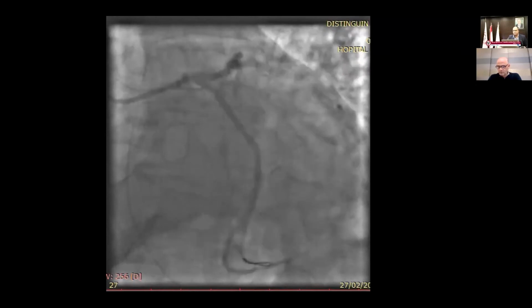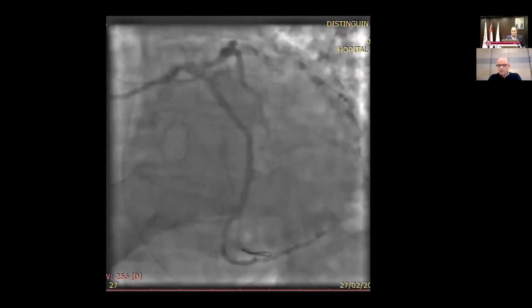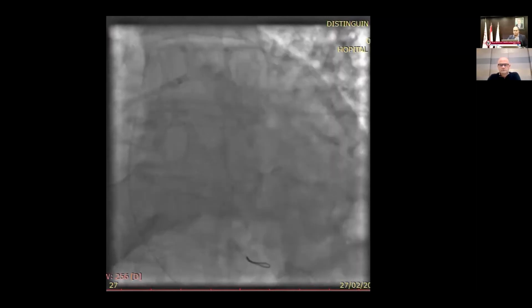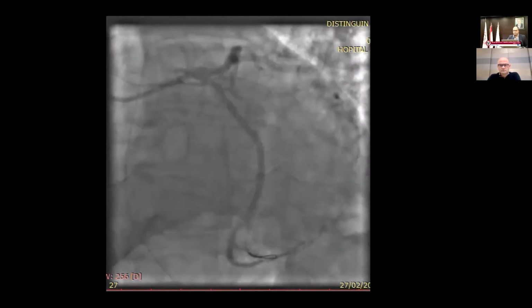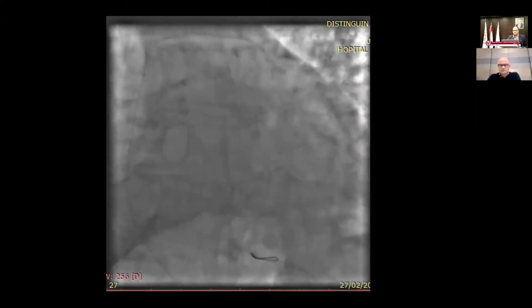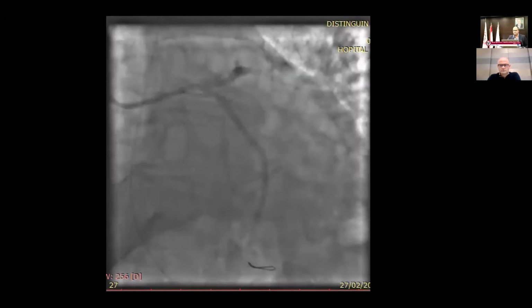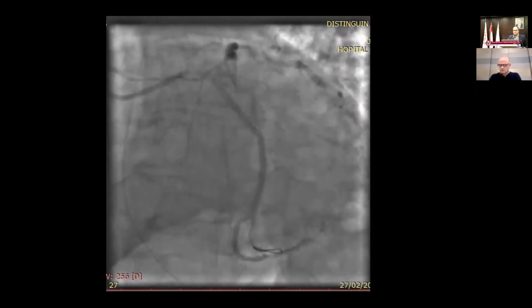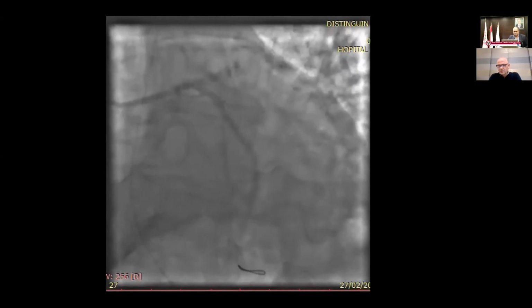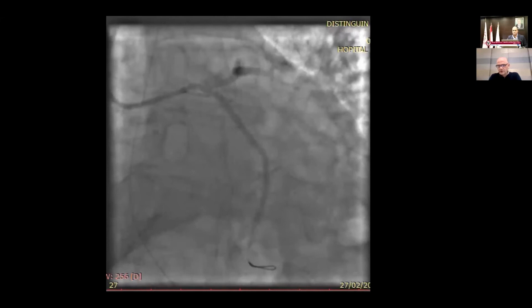Thank you. I think obviously great job on the circumflex, and I would have done exactly the same. The circumflex had TIMI 2-ish flow and is a big circumflex and almost co-dominant. And that's exactly where I think all of us would have started. And no one can argue with the balloon pump when you're working with a pressure of 70, despite the randomized clinical trials that we're all aware of. That's a bit controversial, but all of us who do this on a daily basis would feel better working on this patient with an intra-aortic balloon on top of the dobutamine you started.